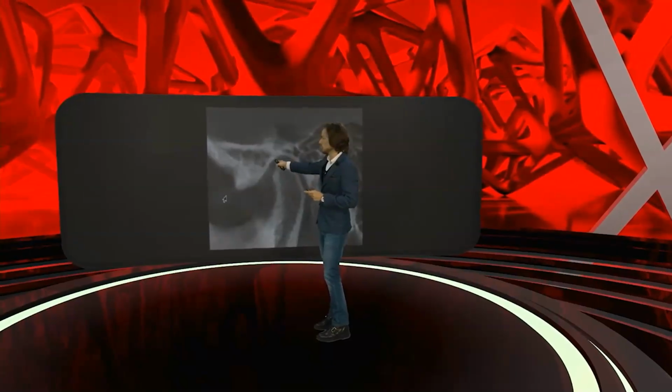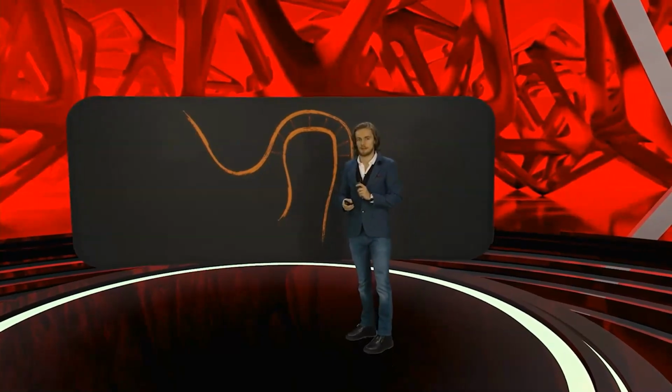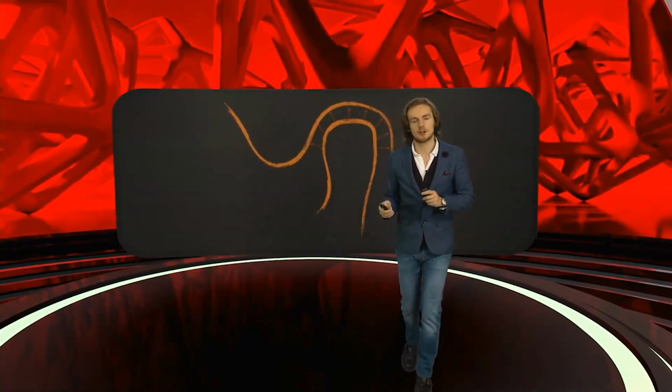In here, everywhere is symmetrical. It looks like a very stable joint. When you look at these contours, you also see a very nice position, right? There's a pure symmetry. But think about it, where is the space for the disc in here? And is the disc flat or is the disc biconcave?